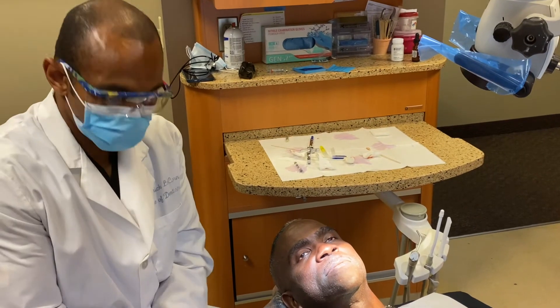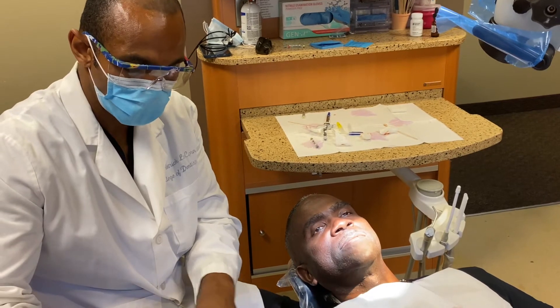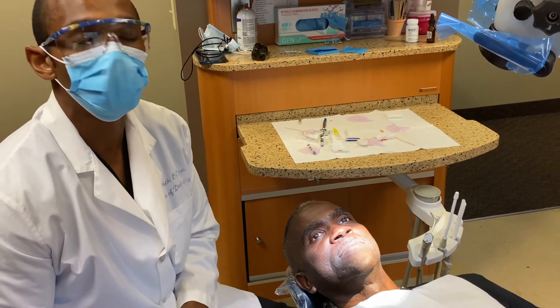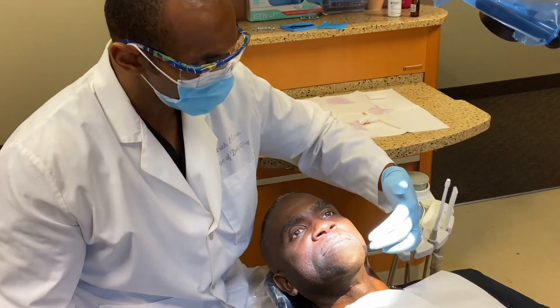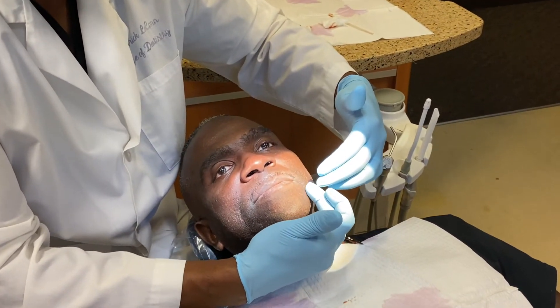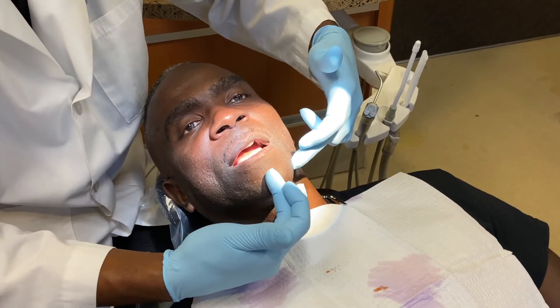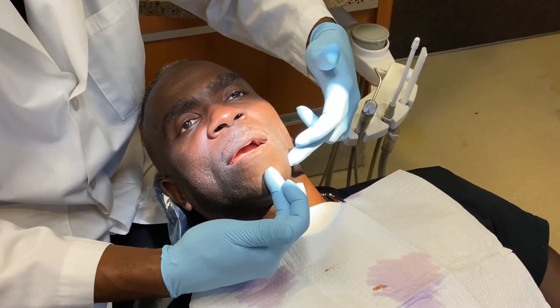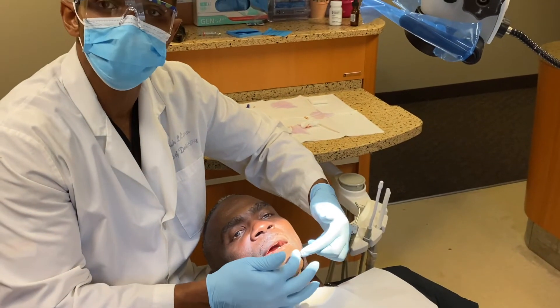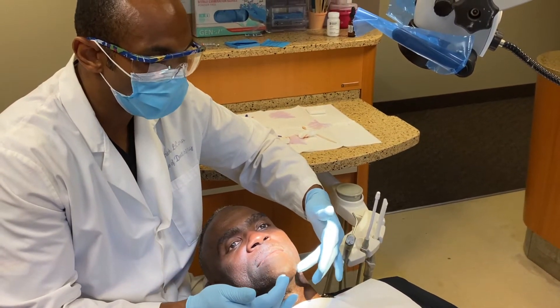The last injection we'll be discussing is the mental block. We're going to be aiming for the mental foramen, which is just slightly distal to the second mandibular premolar. The mental block is really good for anything from the premolars forward to the midline — our two premolars and our mandibular lower incisors. This injection is also very good for any type of lip lacerations, suturing in the chin, or lacerations in the lower lip area.